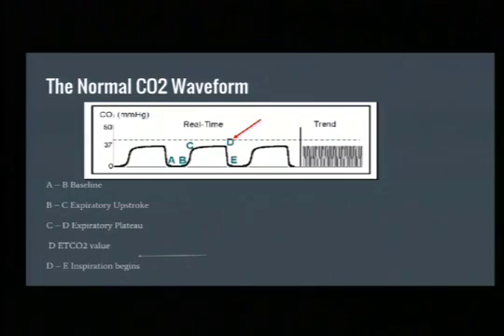Looking at the different phases, kind of what I went through, A is your baseline, A to B, that kind of flat. That's your inhalation and sitting there before you exhale. This is kind of that fast beginning to exhalation, and then D is maximum expiratory of all your gases right before you take your next inspiration. So again, that's what you're looking for, is where your peak is.